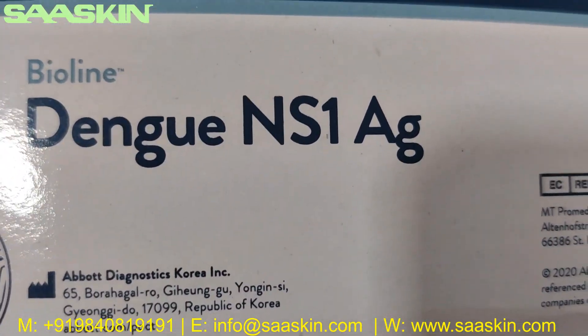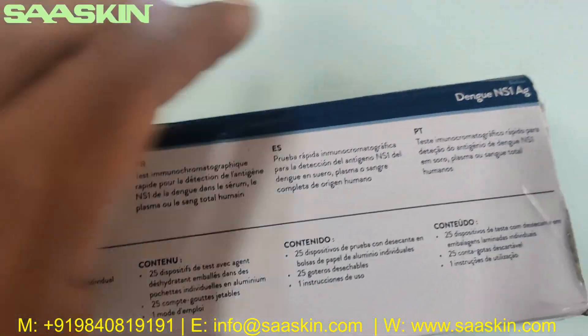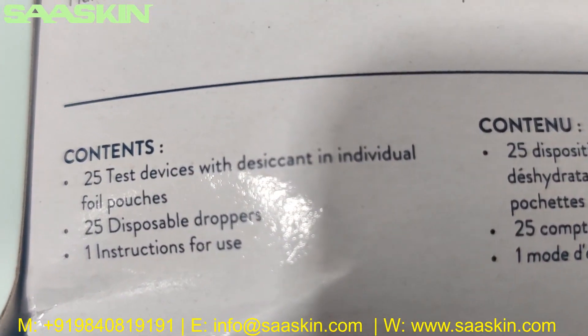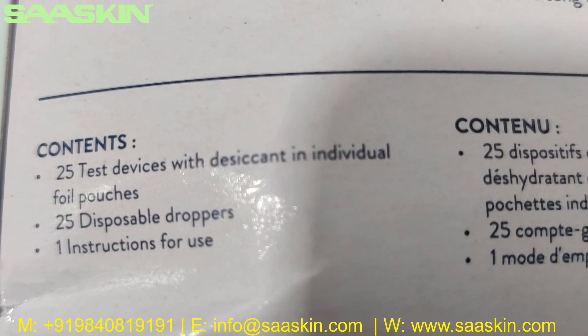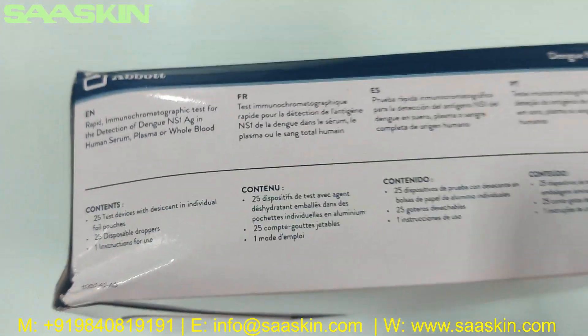From Abbott Bioline Dengue NS1 Ag — inside the box you get 25 test devices with individual pouches, 25 disposable droppers, and an instruction for use.